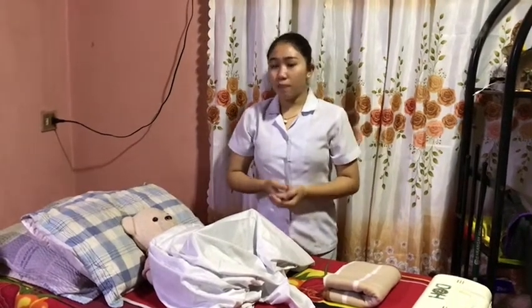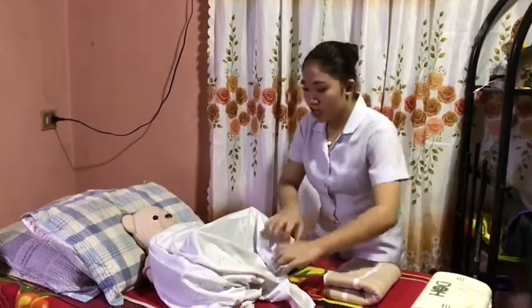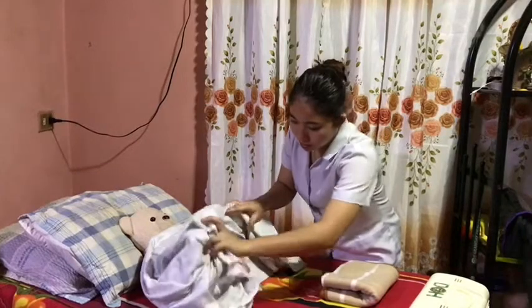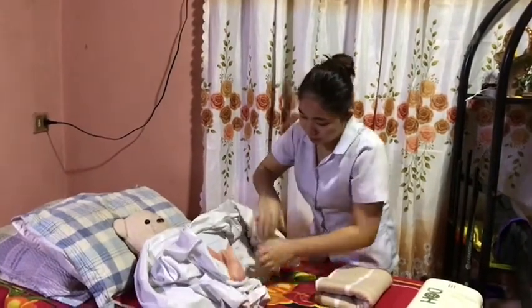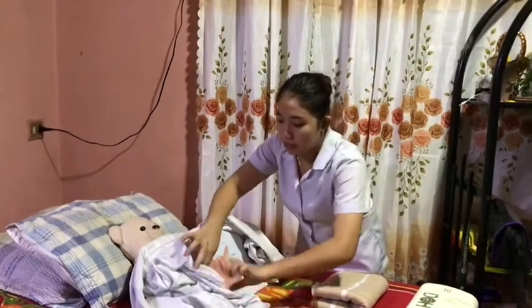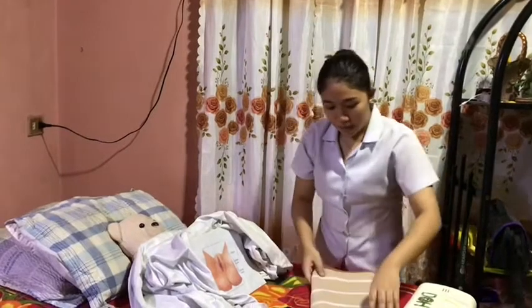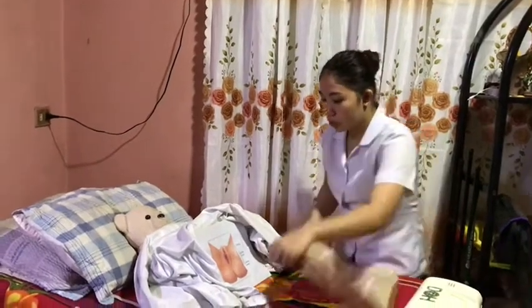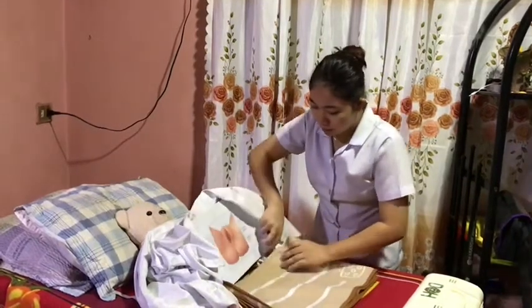Alright. Now, drape the patient, exposing only the area to be used. This is done to avoid the patient from getting embarrassed. Okay, ma'am, I'm going to expose your genital area. Alright. And now, I'm going to put this pad underneath you to prevent the bed linens from getting soiled.